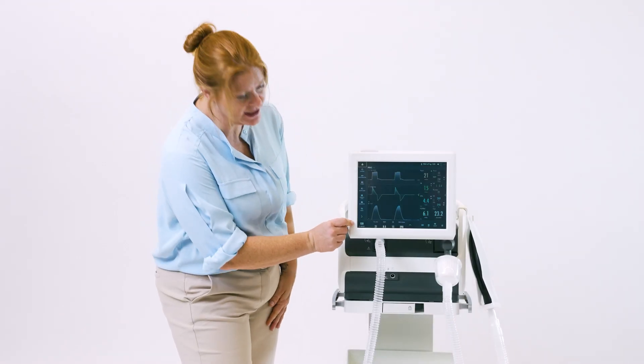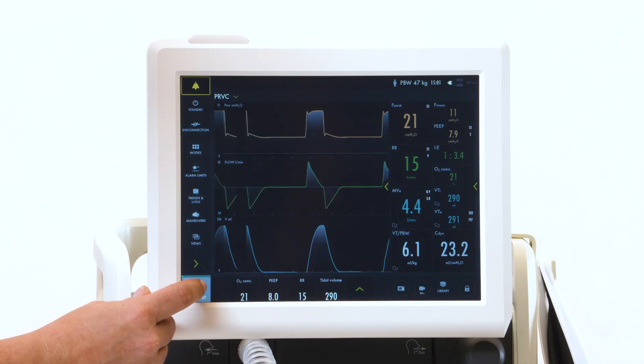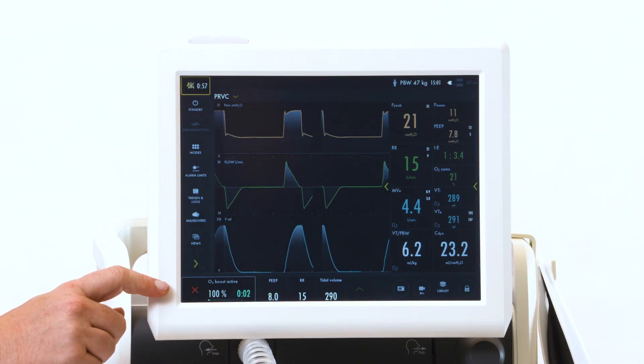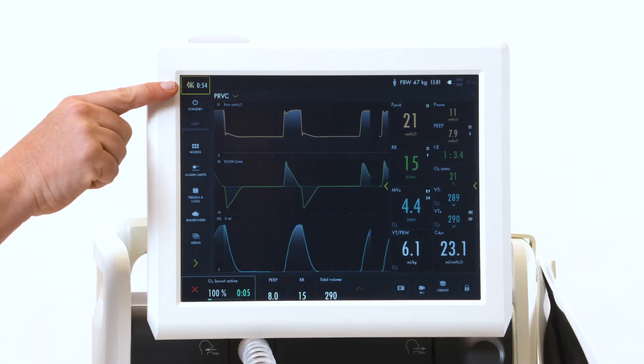The O2 boost is located down here. To activate, touch and hold until the blue bar goes across. It will give you a minute's worth of that O2 and silence your alarms for a minute.